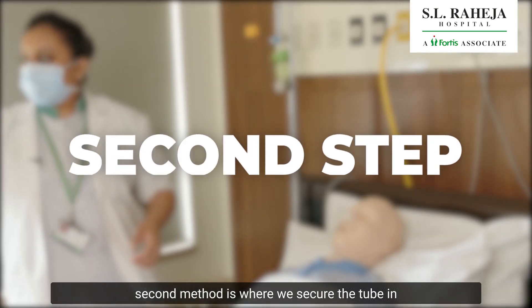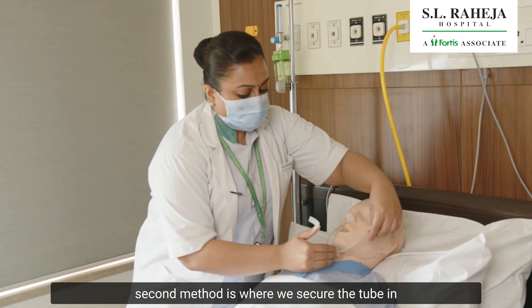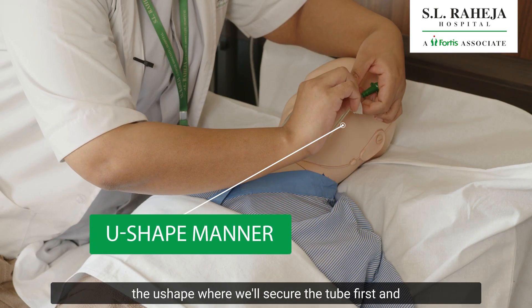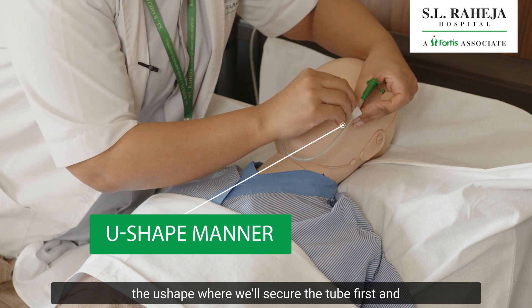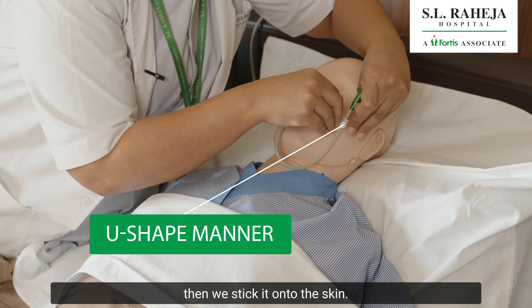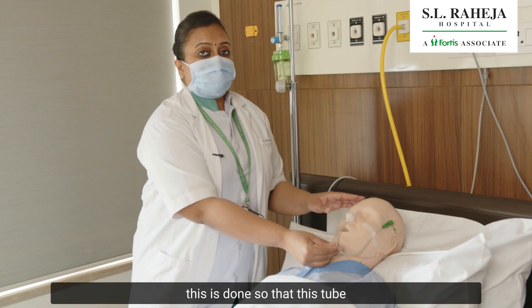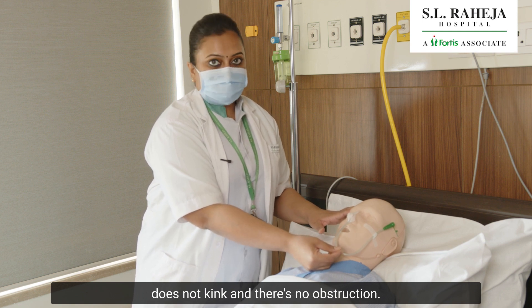The second step is where we secure the tube in a U-shape, where we will secure the tube first and then stick it onto the skin. This is done so that the tube does not kink and there is no obstruction.